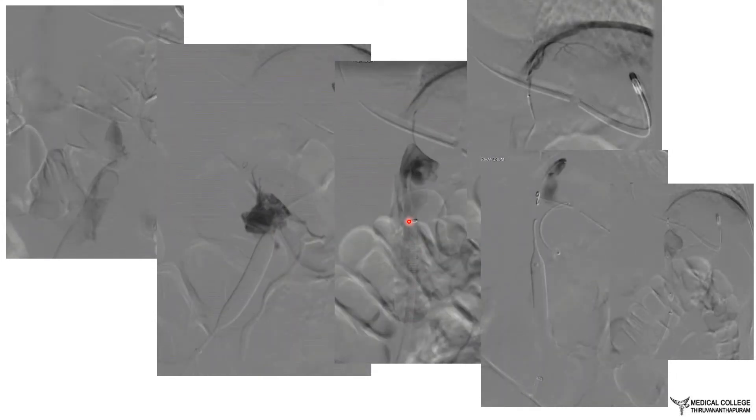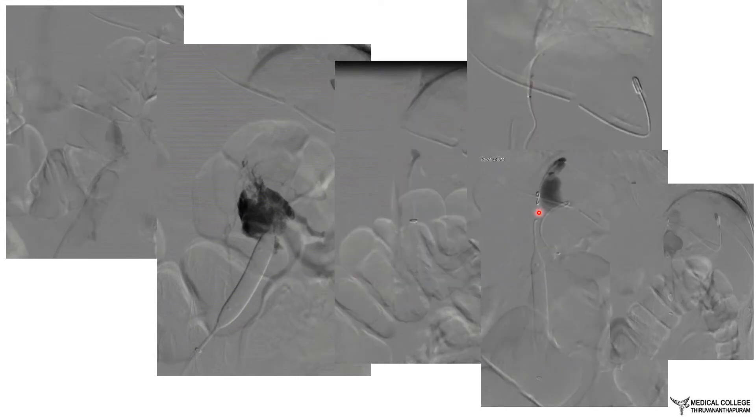The patient was taken for BRTO via right femoral access, with cannulation of the gastro-renal shunt and balloon occlusion. During balloon inflation and contrast injection, there was inadvertent rupture of smaller retroperitoneal veins; however, most such bleeds are self-limiting. Repositioning the sheath and repeat angiogram showed filling of the gastric varices and a small efflux through the inferior phrenic vein. Since unoccluded outflow through the inferior phrenic vein would allow sclerosant to efflux, we selectively cannulated it, placed a coil to embolize it, then injected sclerosant mixture through a micro-catheter with the balloon inflated.